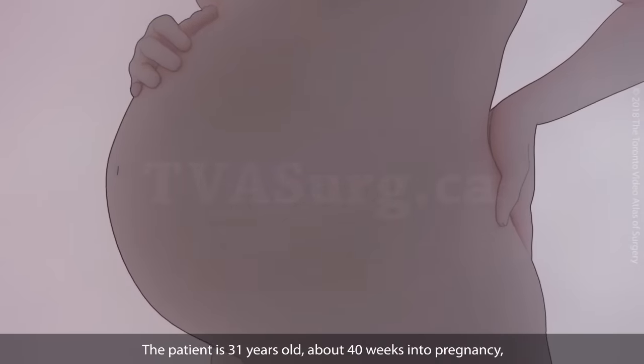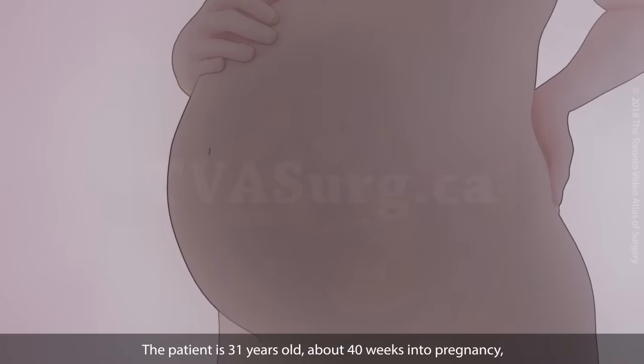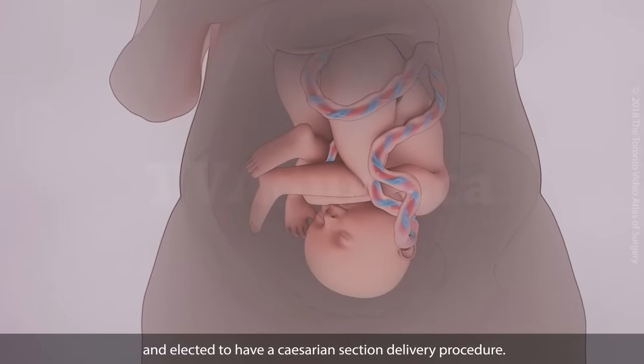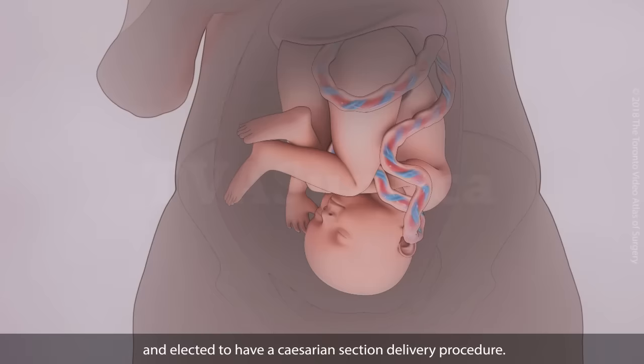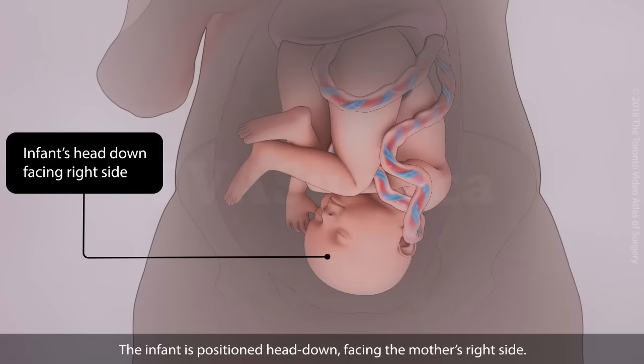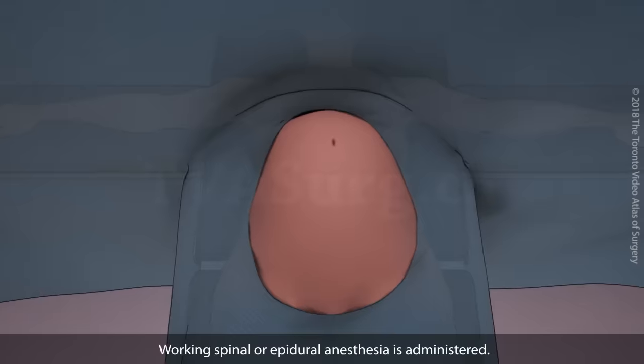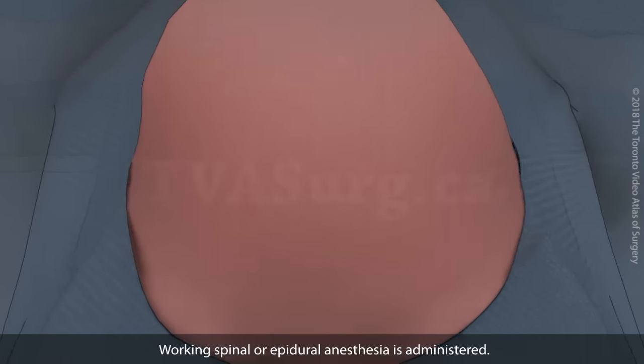The patient is 31 years old, about 40 weeks into pregnancy, and elected to have a caesarean section delivery procedure. The infant is positioned head down, facing the mother's right side. The patient is placed in a supine position with a drape screen set up. Working spinal or epidural anesthesia is administered.